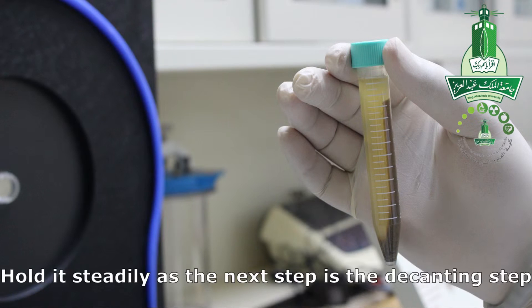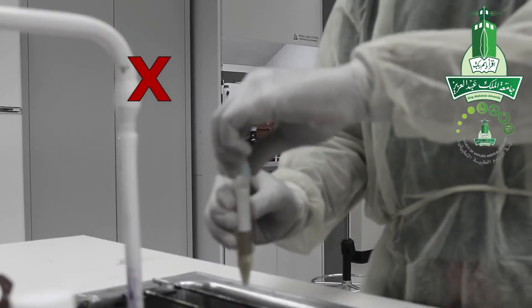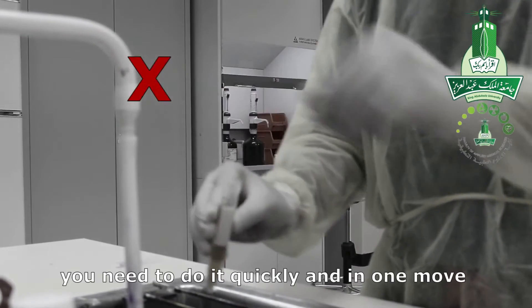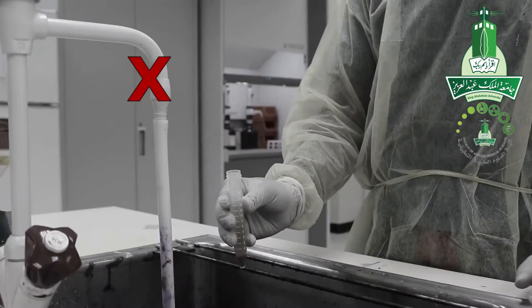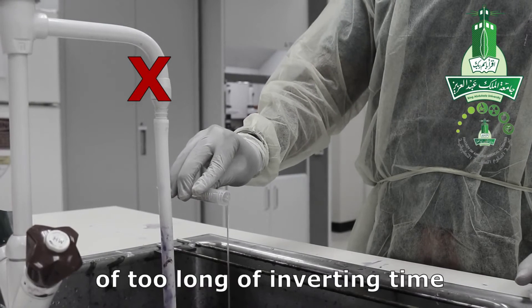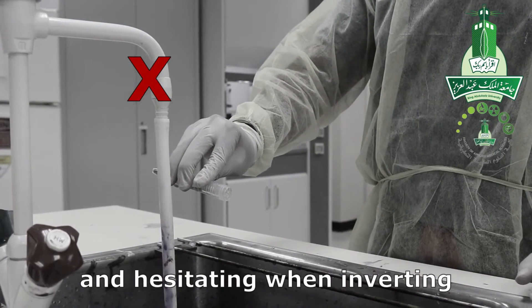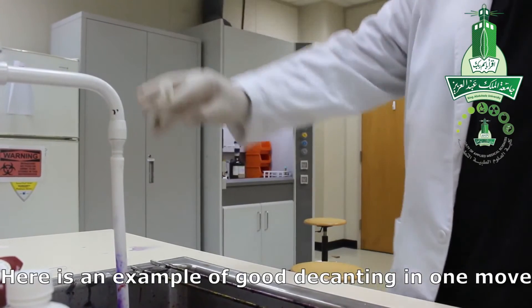Hold it steady, as the next step is the decanting step. When you decant your sample, you need to do it quickly and in one move — you cannot hesitate. Here are two bad examples of inverting too long and hesitating when inverting, and here is an example of good decanting in one move.